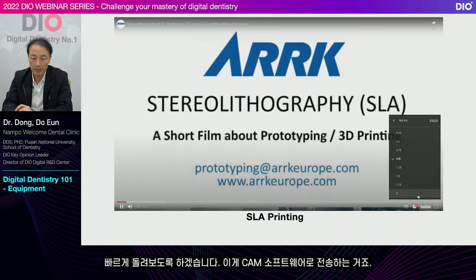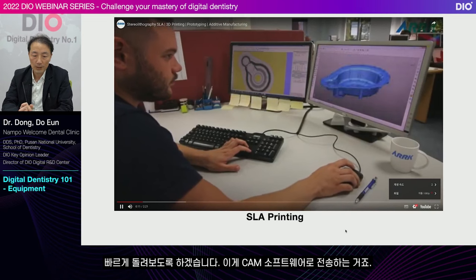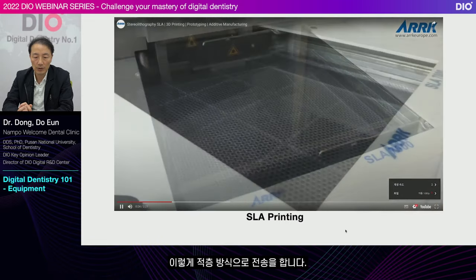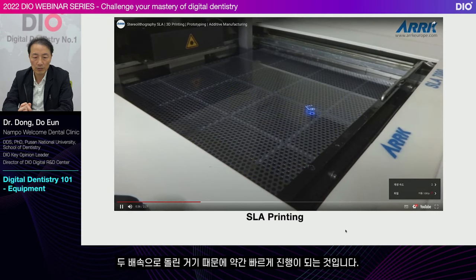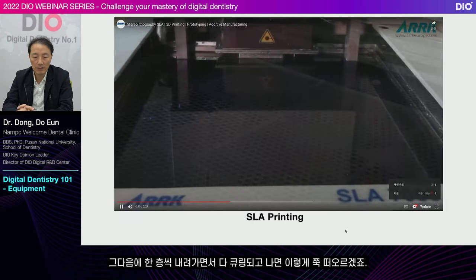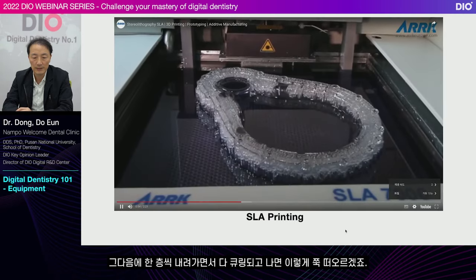I'll fast forward. It's sending to the CAM software. It sends it in the layer method, like this. Do you see the lasers passing through? It's at 2x speed, so it's going a bit fast. It cures when you shoot the laser. Then, as it goes down one step, it cures and floats like this.